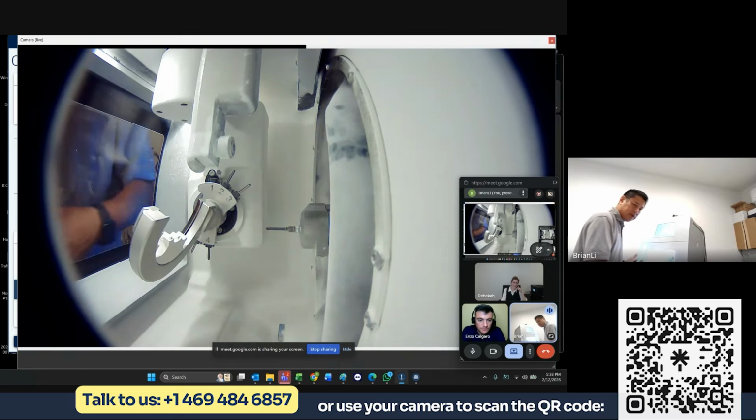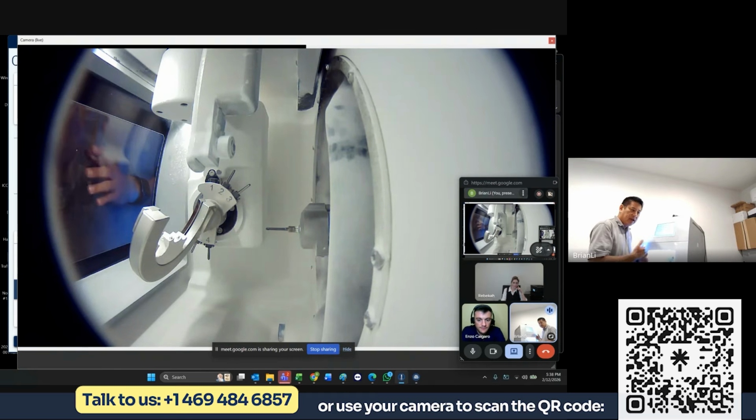So what happens with us is we have these cameras in here, and it's basically recording the last, I don't know, between 5 and 7 mills, depending on how big the jobs are. But if at some point there is an error message that shows up on your mill, the system will go back and record 15 seconds before the error up until the error happens.